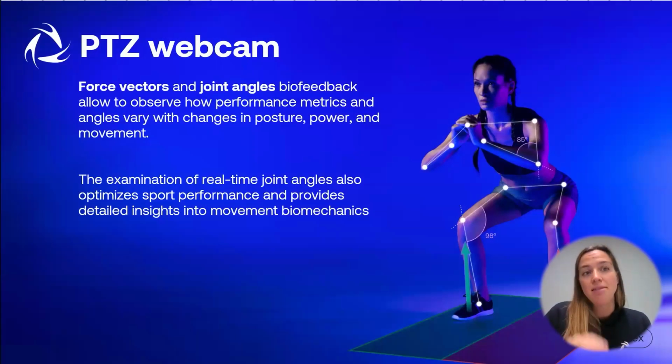The PTZ webcams are HD color webcams that allow superimposed force vector biofeedback during the movement. So when you stand on the force plates, you will see the left and right superimposed vectors that show in real time the loading and the distribution of the load during movement or also during static analysis.